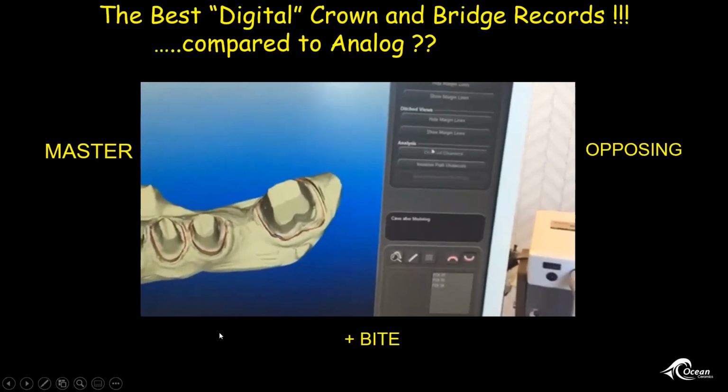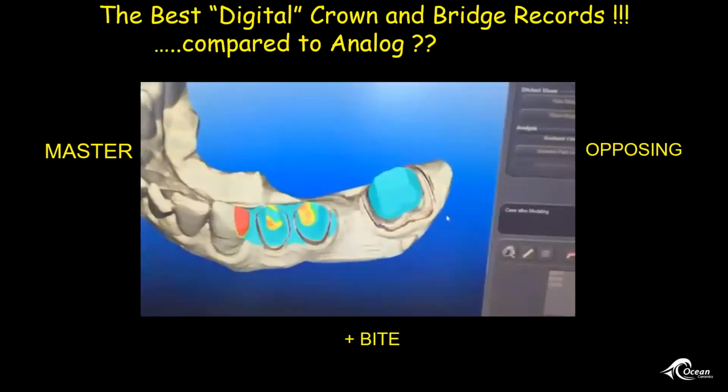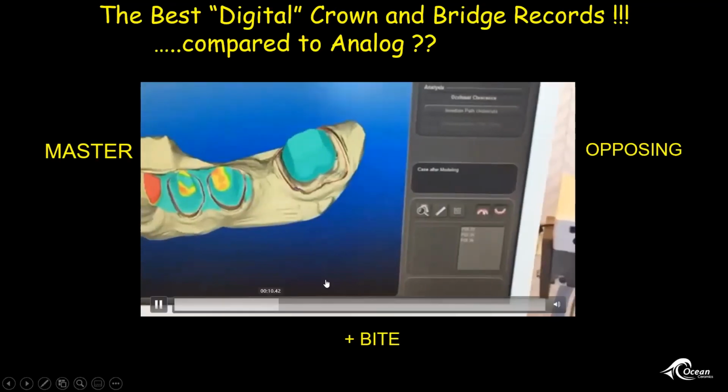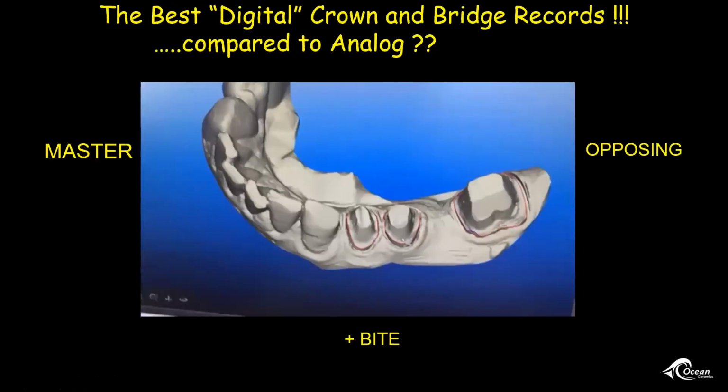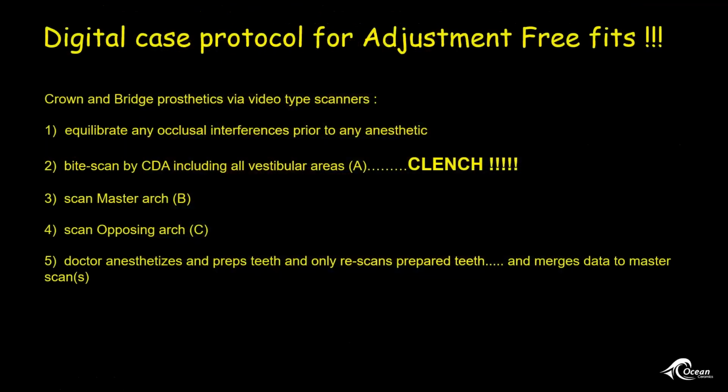Just to his point about, did you capture the right bite? I don't know if it's in here. Okay, so when the screen comes up with both on, and you hit the don't show thing, it's been trimmed. Because it's just a surface representation of it, you can tell if the teeth on either arch are touching by looking through one side or the other, because it shows up like the color. There are 2 different colors on the inside, and if it shows up in a couple of different colors and you've got 3 points, you know they were clenching when they did it, so that the bite will be accurate.